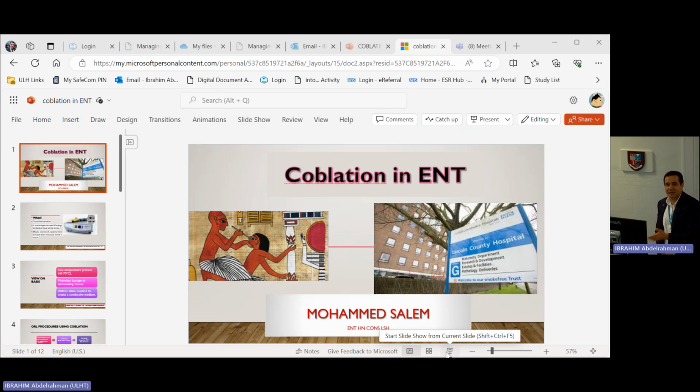So sometimes if you plan to go for intracapsular, you find yourself passing the capsule when you start, or the other way, when you start the extracapsular, you find yourself taking much from the muscle. When you do the intracapsular, you're doing it mainly with a scraping motion from inside outside.